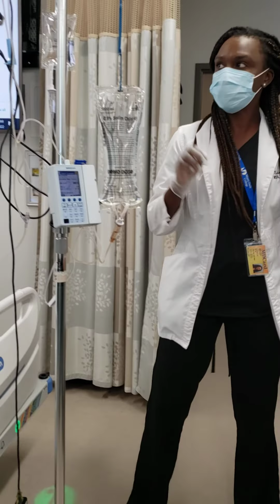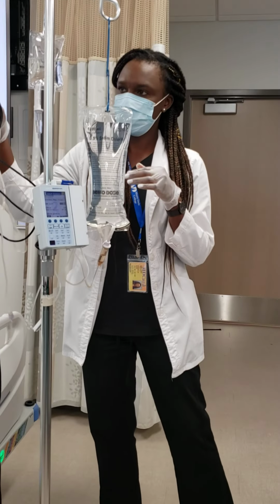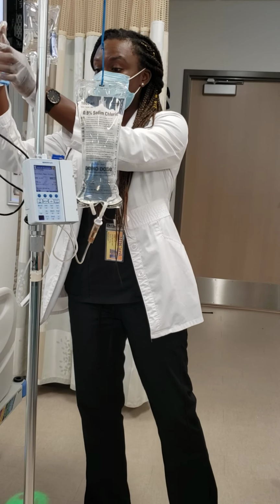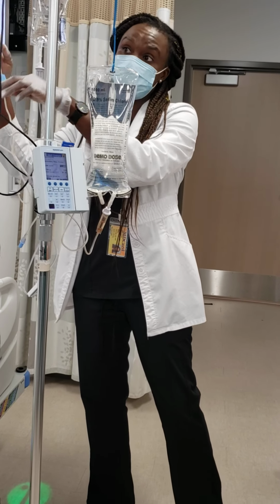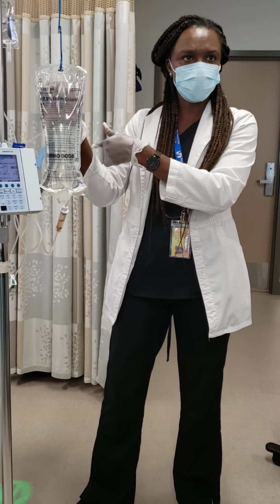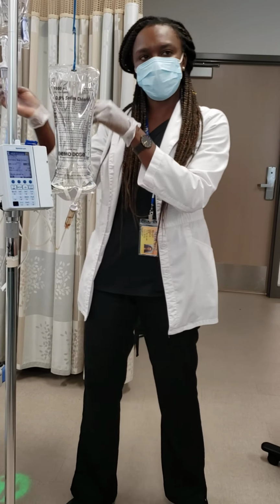Quick question. Which fluid will go into the one closest to the patient? Nothing. You can use that to do IV push. Like if you have to give a medication that you push directly into the line, you can do it there. Okay. Yeah.